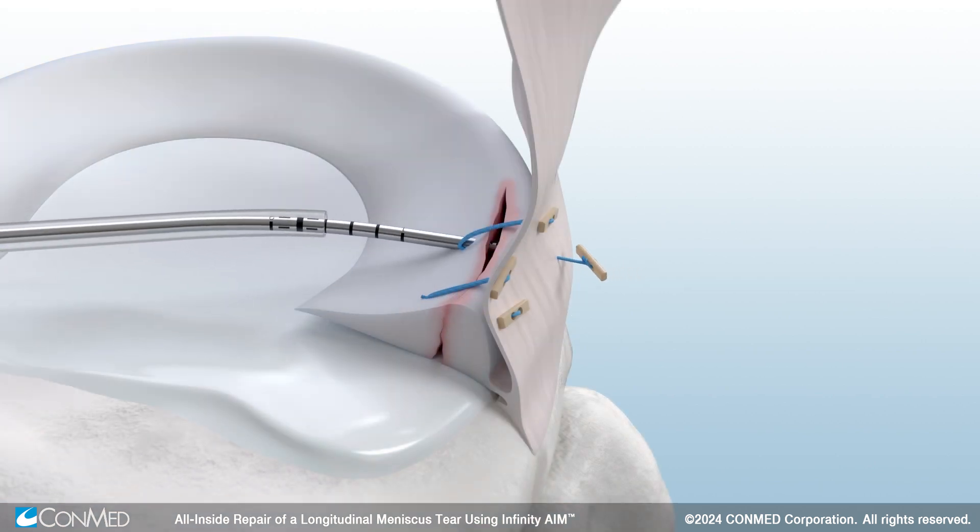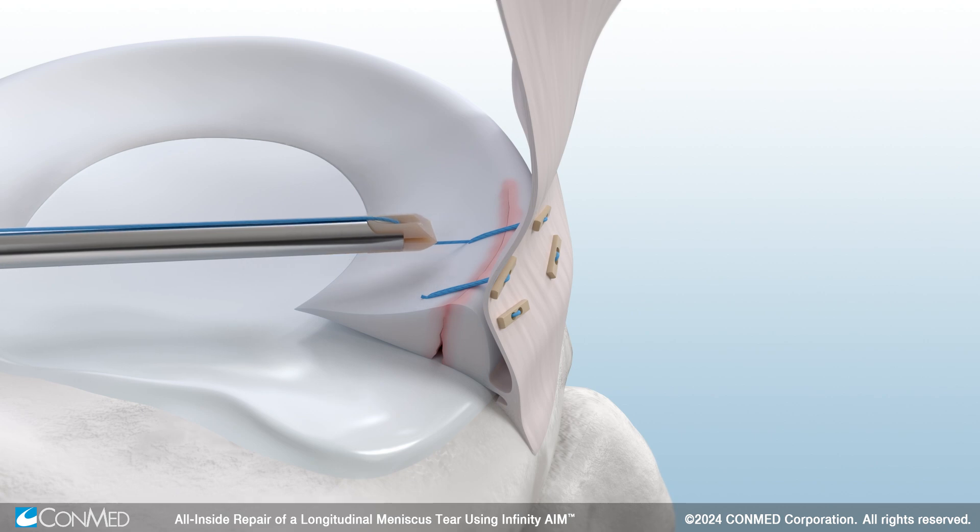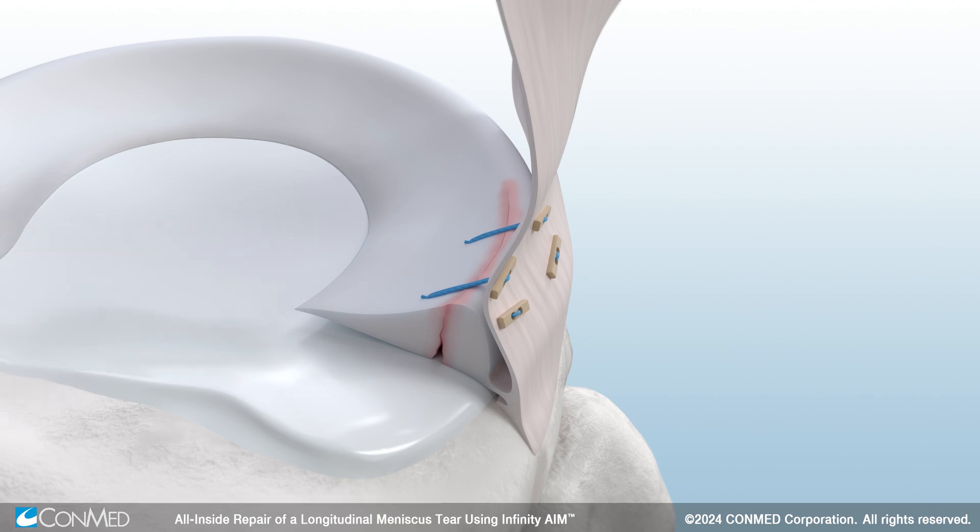A second Infinity Aim device will be used on the superior aspect of the meniscus. By cinching the superior part of the tear first, it allows the meniscus to flip proximally and allow visualization of the inferior side of the tear.